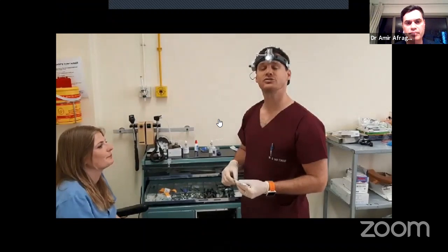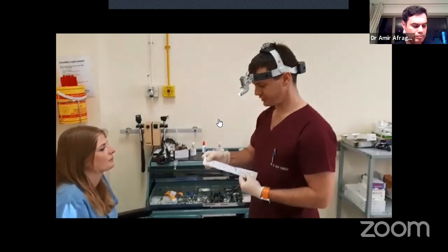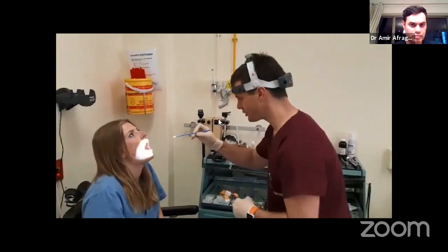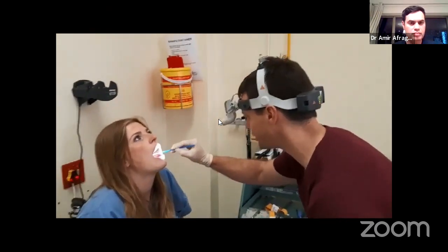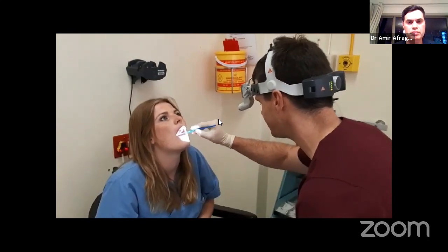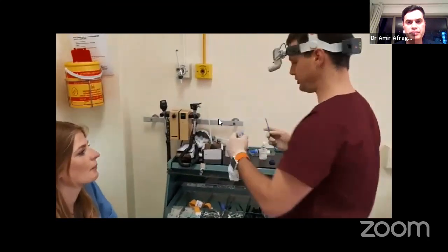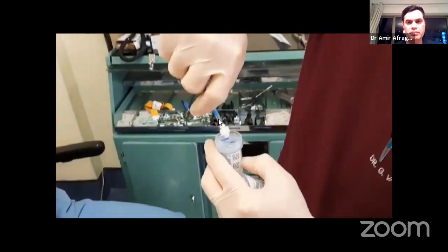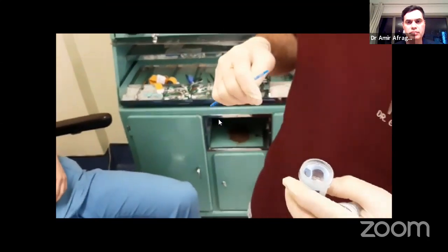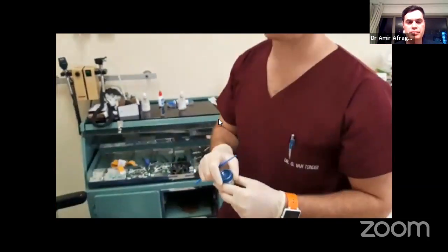Hi, so we're going to show you how to use the Orcellex brush to take a sample in the oral cavity of a patient. Using the Orcellex brush by Rovers, the brush is inserted into the oral cavity and the lesion bed is brushed 10 times in a clockwise direction until contact bleeding is achieved. The brush is removed and, using the CytoRich vial, the head of the brush is inserted, sliding forward the see-through sheath into the large hole, into the CytoRich fluid, and the vial is closed.